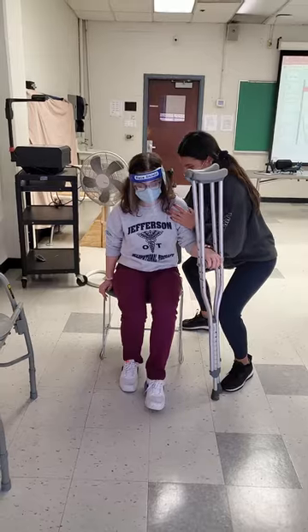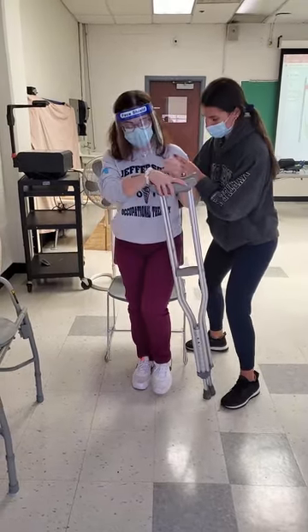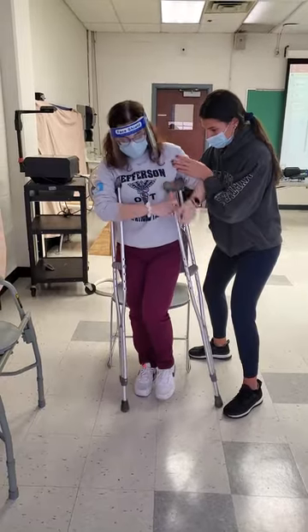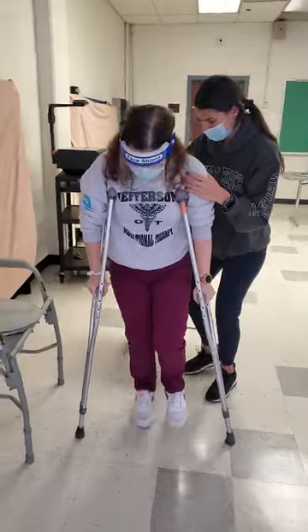Okay, ready? One, two, three. Stand up. Put your crutches under your arms. And we're going to crutch forward, crutch forward, and then hold on.